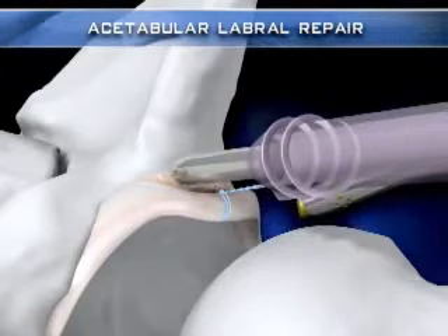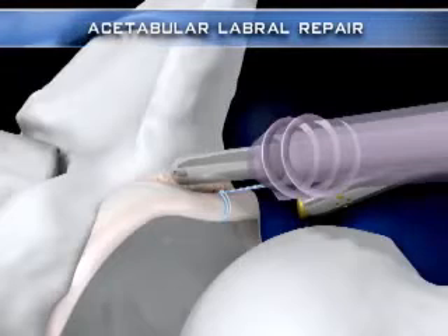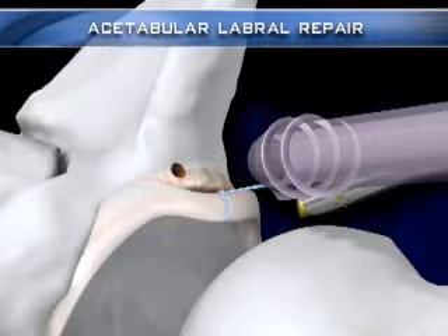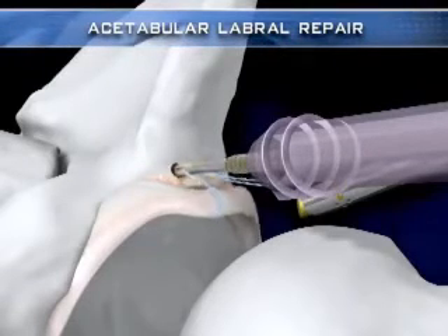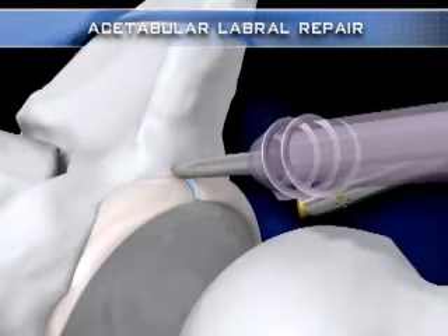A hip pushlock spear and drill are then utilized to create a socket for the knotless pushlock anchor. The anchor is then slid down the tails of the cinch stitch and placed into the socket prior to impaction to check tissue tension. Impacting the plunger on the back of the pushlock handle advances the anchor into the socket without further tensioning of the suture tails or tissue.